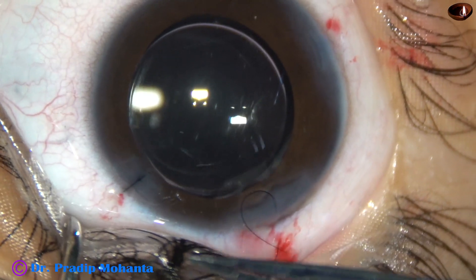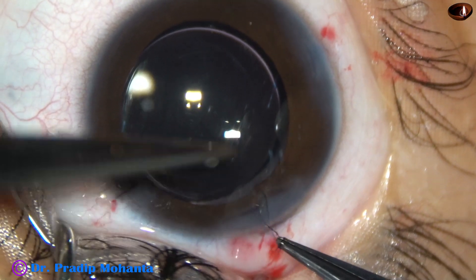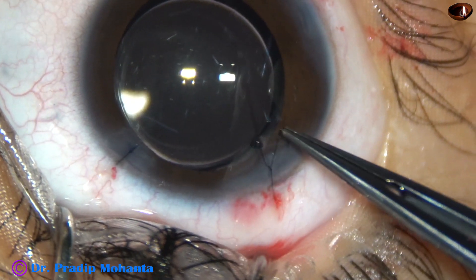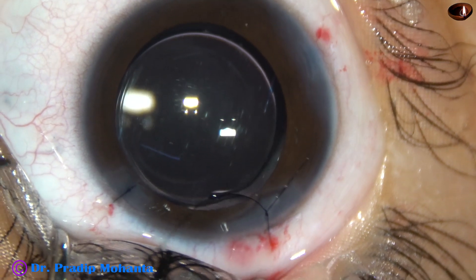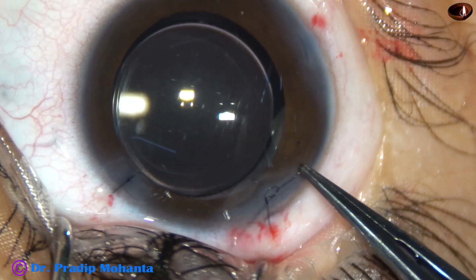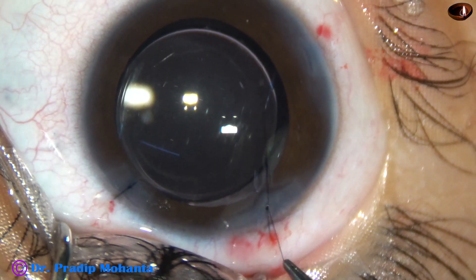The anterior chamber is nicely formed. But since I have put this suture, it is good because if there is any pressure on the eyeball, this wound will not open. So we are towards the end of this surgery.